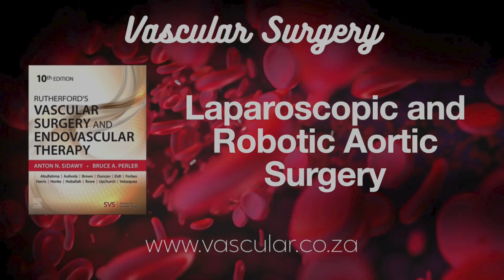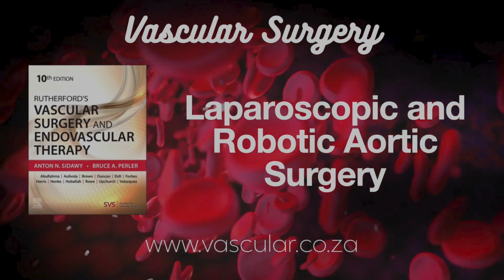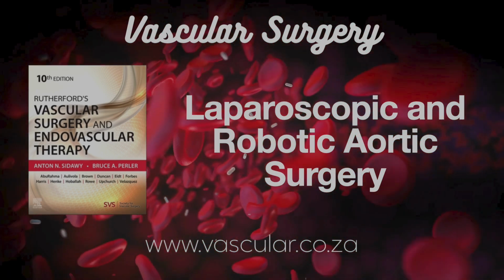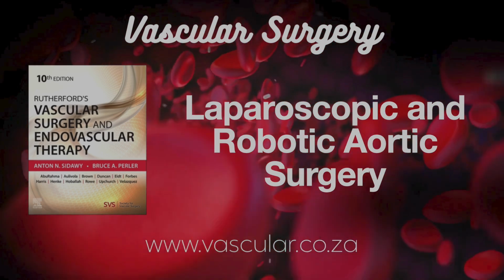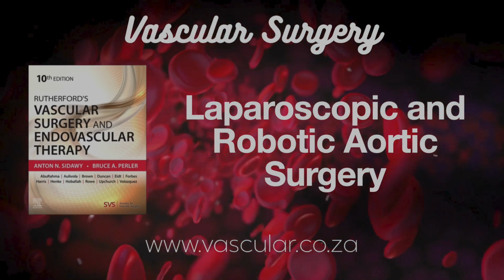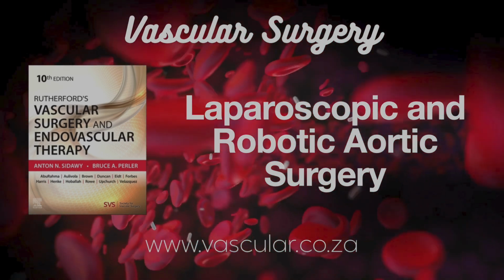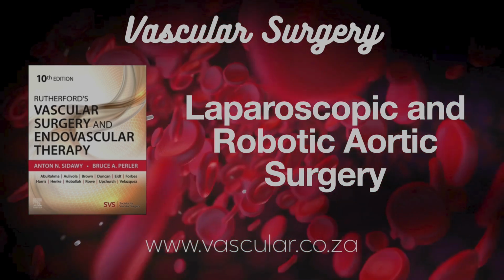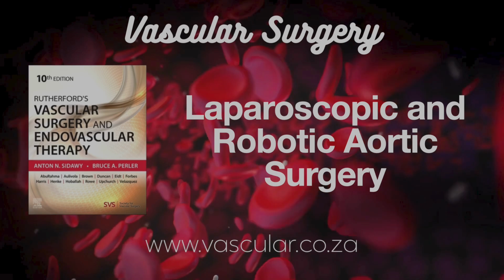That's where the surgeon actually sits, maybe across the room. They're not right at the patient. Nope, they're looking into the console, controlling the robotic arms remotely. But the key is their hand movements at the console translate very directly, very intuitively to the robot's movements. It mimics open surgery feel, but through tiny holes. That sounds like it could really help bridge the gap from open surgery skills.